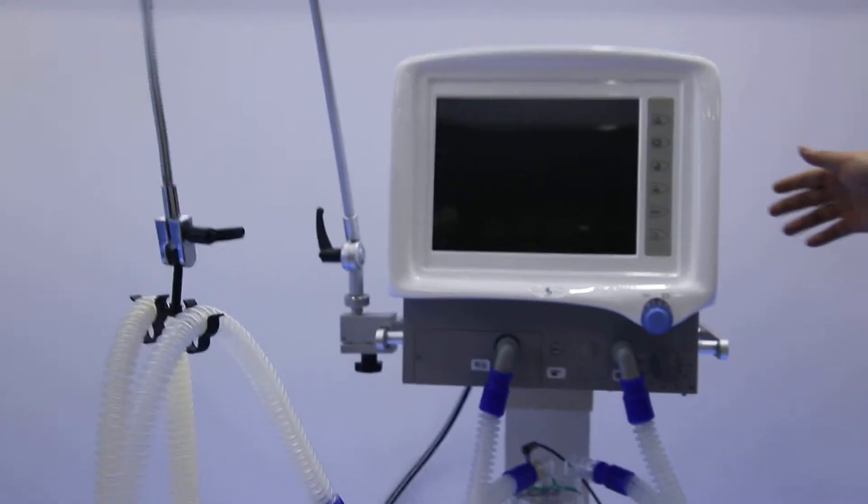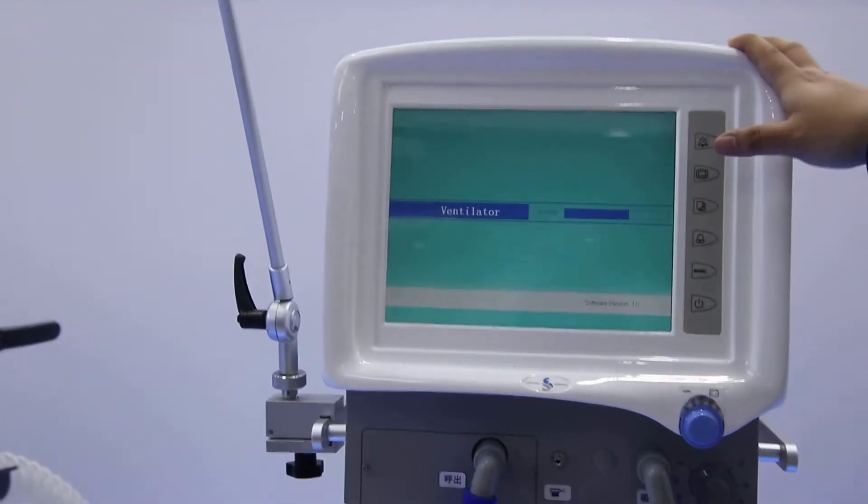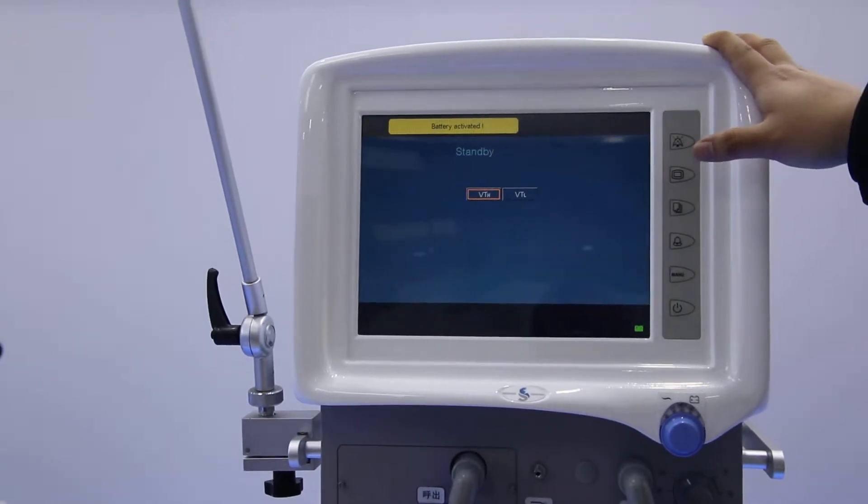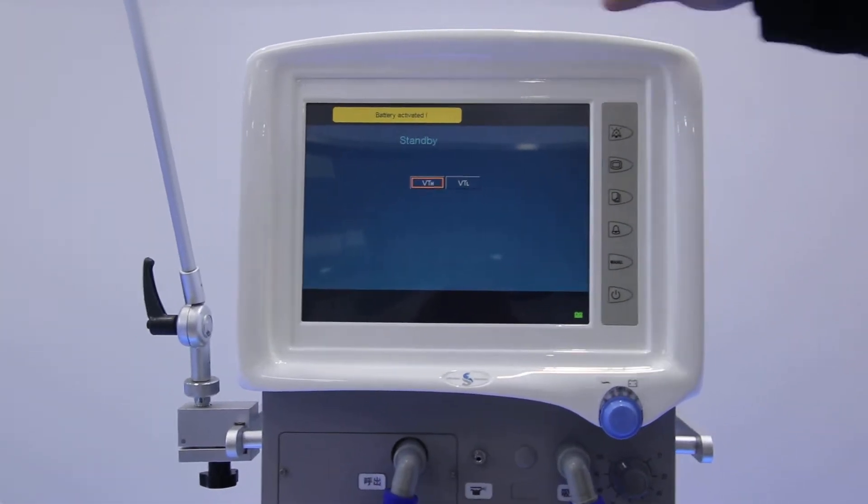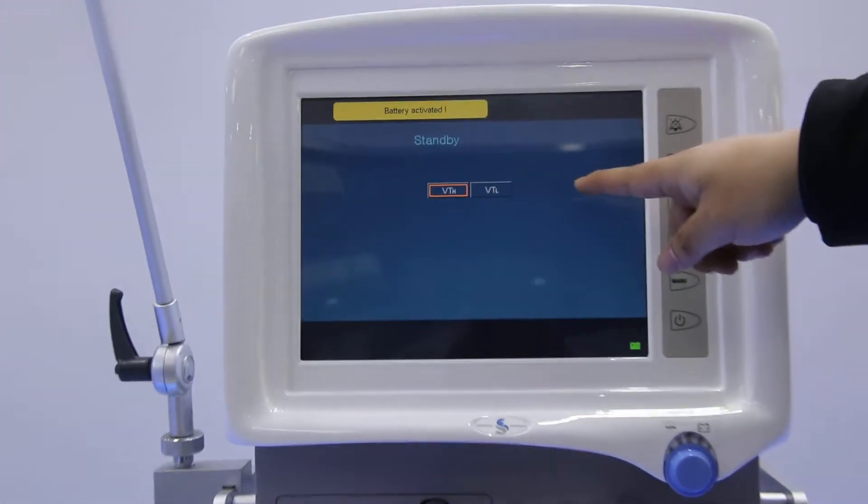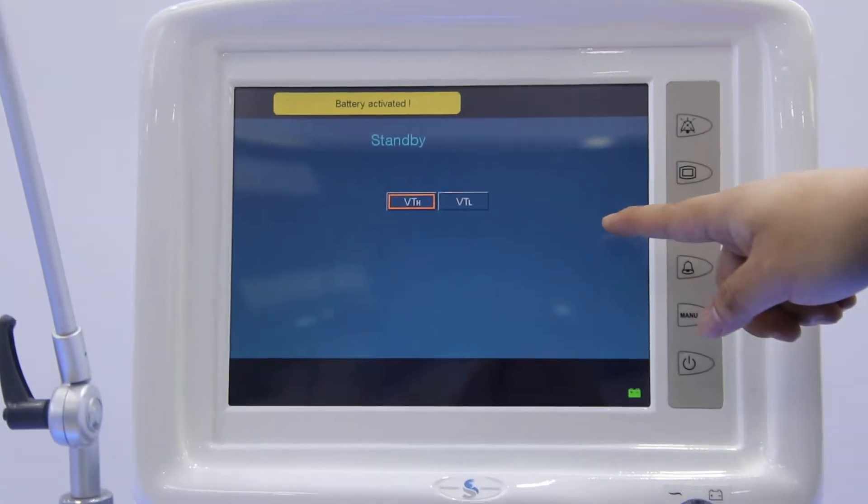First, we turn on the power on the back side of the machine. You will see the machine first goes into self-testing to protect the machine and prevent damage to the patient. In the standby interface, we can see there are two choices. First one is for adult and second one is for children and neonatal.